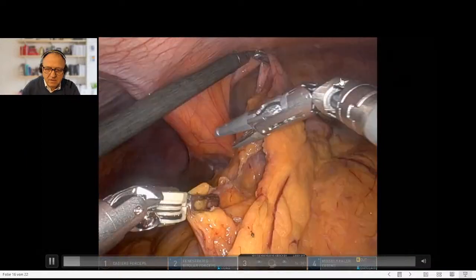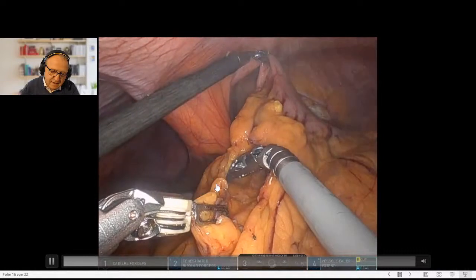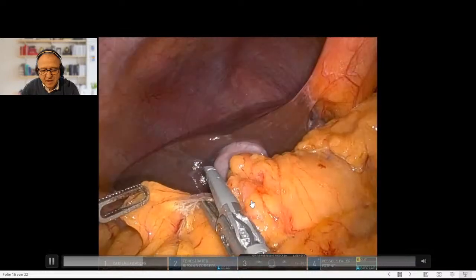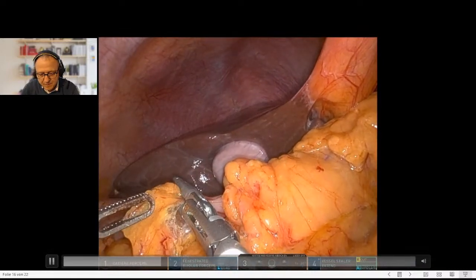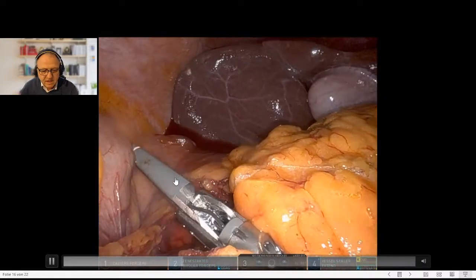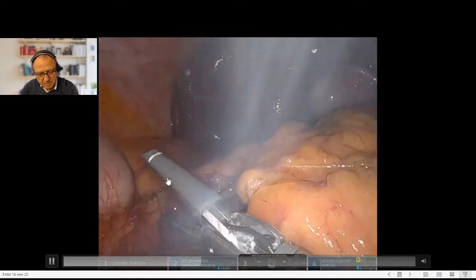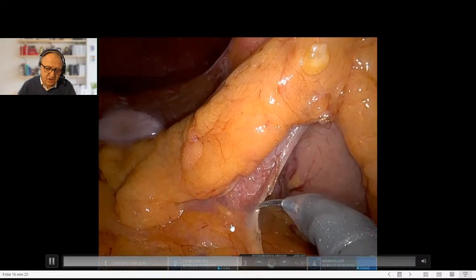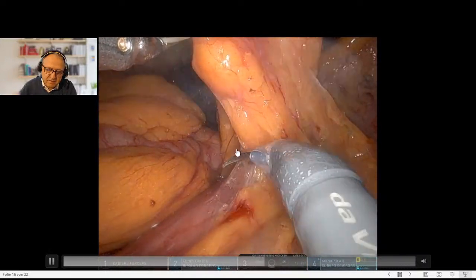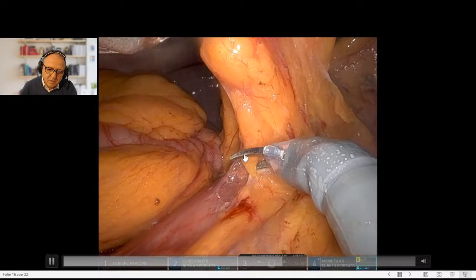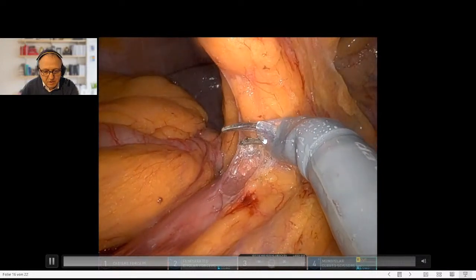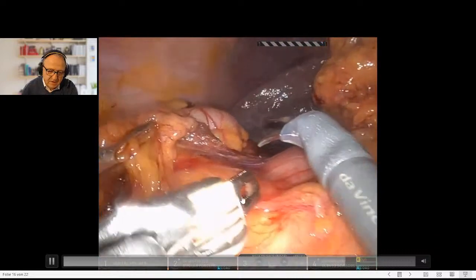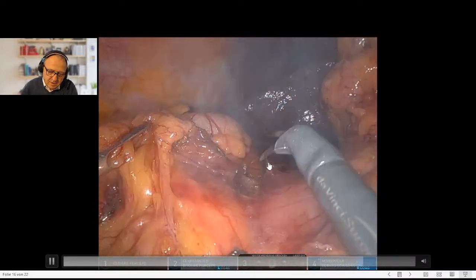In the video you see critical view number five after division of the gastrocolic ligament. Then you further dissect heading for the hepatic flexure. You have to take care not to injure the mesocolon or middle colic vessels. Here we divide the hepatic colic ligament. In this area we enter the dorsal dissection space from the first step. Now the mesogastric fat pad, the dorsal mesogastrium, is dissected away from the pancreatic head. These are the infrapyloric lymph nodes, but they are not a lymphatic drainage area for cecal cancer, so they don't have to be removed.